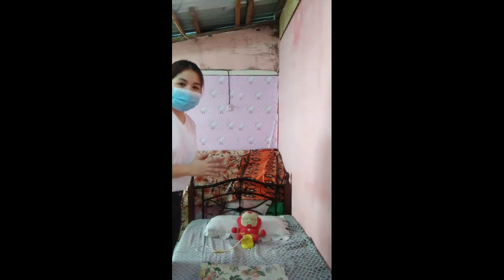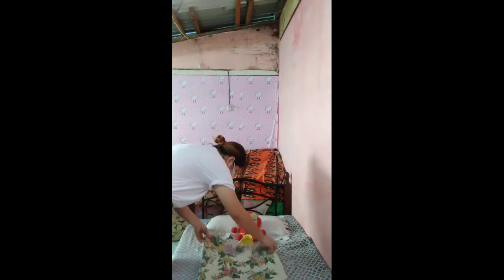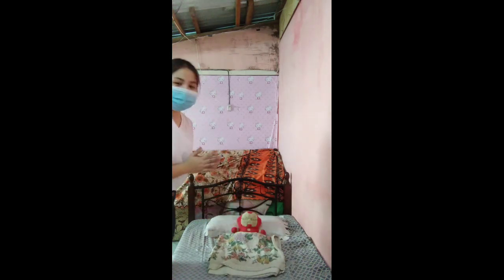After putting away all the materials used in performing the procedure, we need to assist the patient to a comfortable position. So these are down here. So thank you, ma'am. And lastly, we need to document all the important details that were performed for this procedure. So that's all. Thank you.